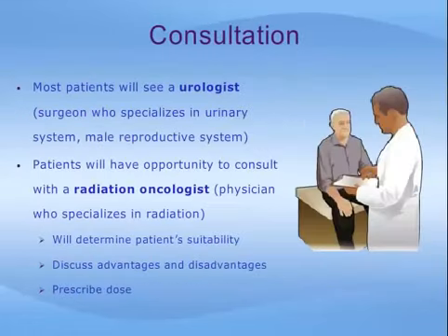Most men with prostate cancer will have been seen by a urologist, a surgeon who specializes in the male urinary system and the male reproductive system, who will offer them the opportunity to consult with a radiation oncologist, a physician who specializes in treating cancer with radiation. During the consultation, the radiation oncologist will determine the patient's suitability for external beam therapy, discuss the advantages and disadvantages of the procedure, and prescribe the dose of radiation to be given.